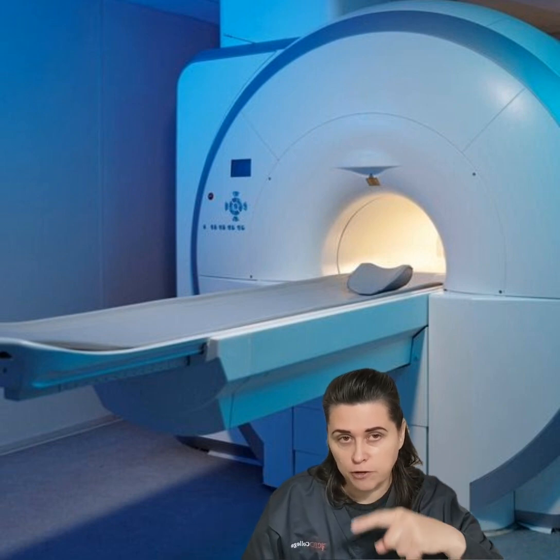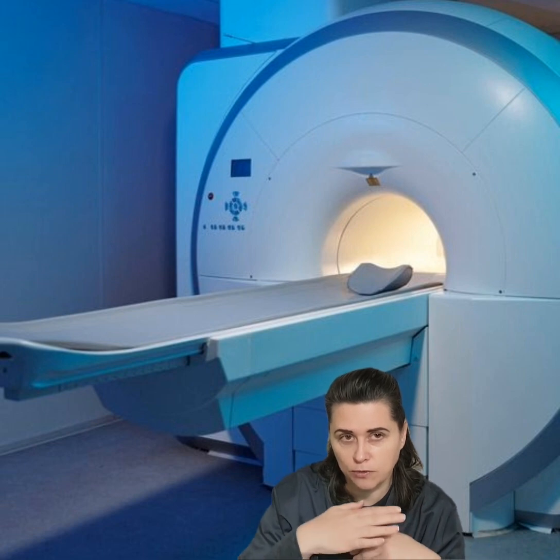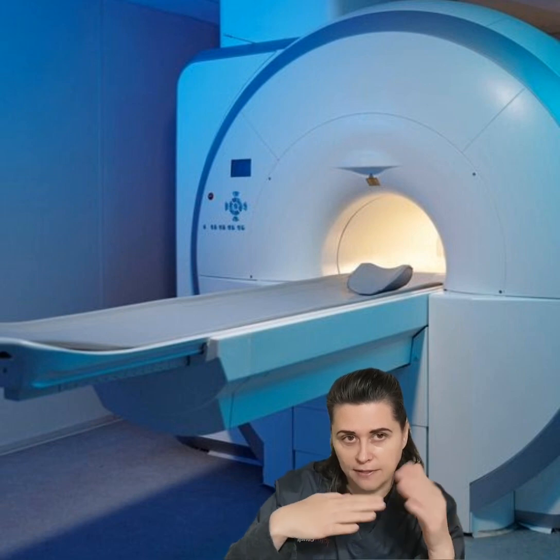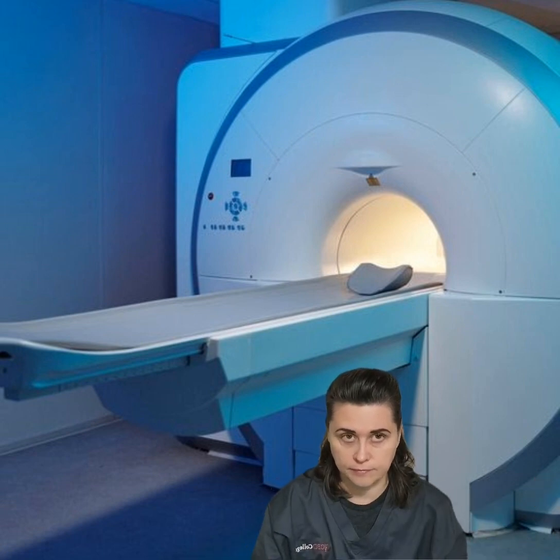We have to be careful because that's where the crosstalk artifact appears. But this is a very important scan, a diagnostic scan. With that, the saturation band is still there, anteriorly. Again, I'm not planning the coronal because my patient is not suffering from scoliosis.